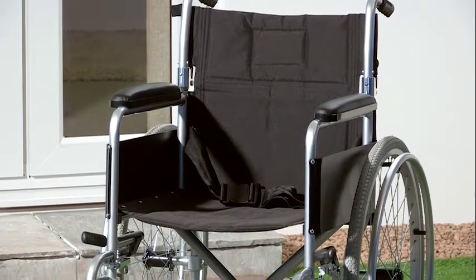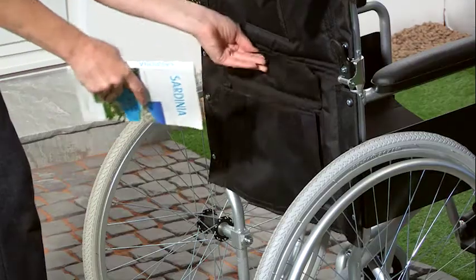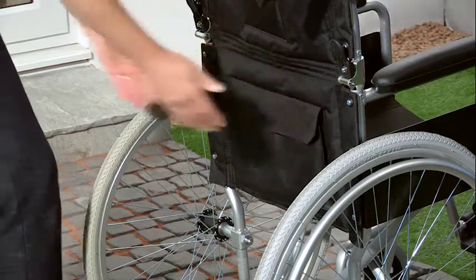This lightweight chair has comfortable nylon upholstery that is easy to clean, and there is also a handy pocket on the rear of the backrest which is great for a few essentials when you are out and about.